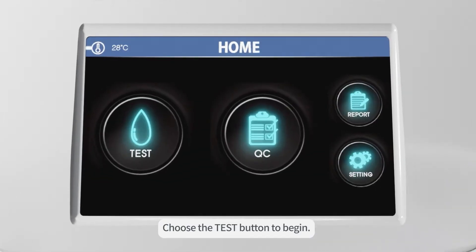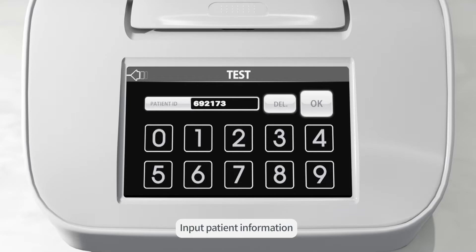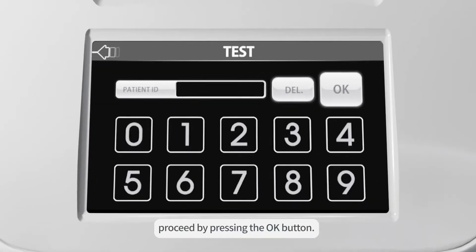Step 1. Preparation for Testing. Choose the Test button to begin. Input patient information. If not, proceed by pressing the OK button.